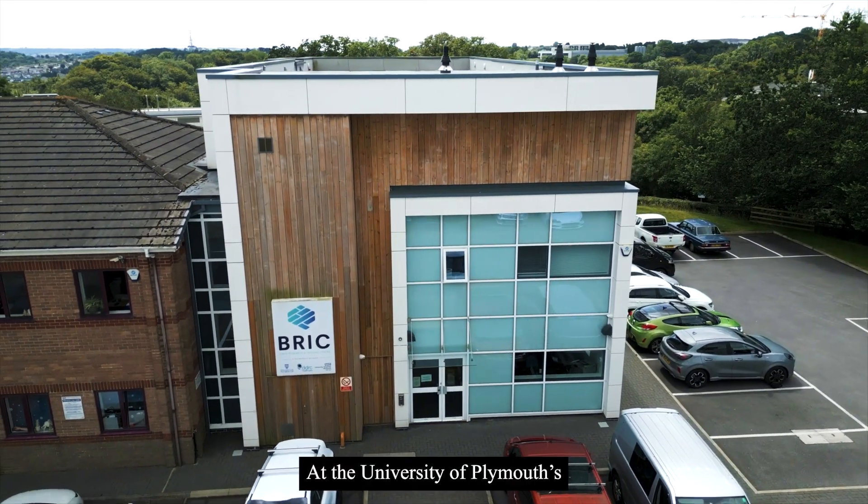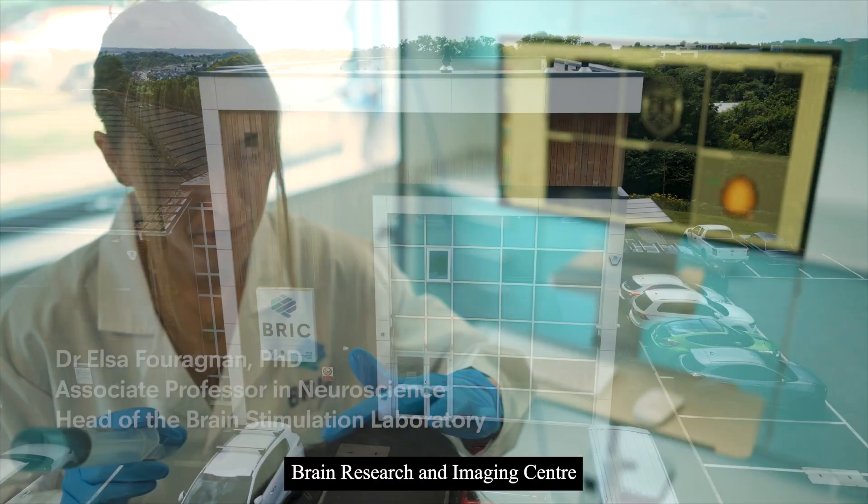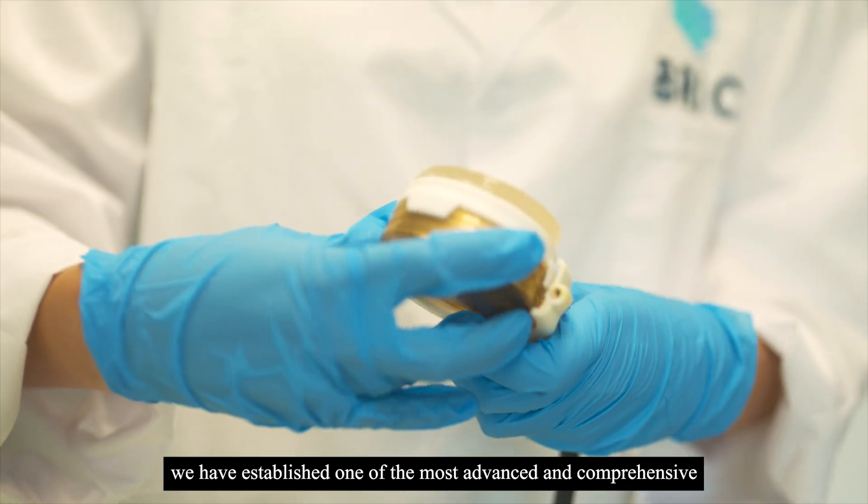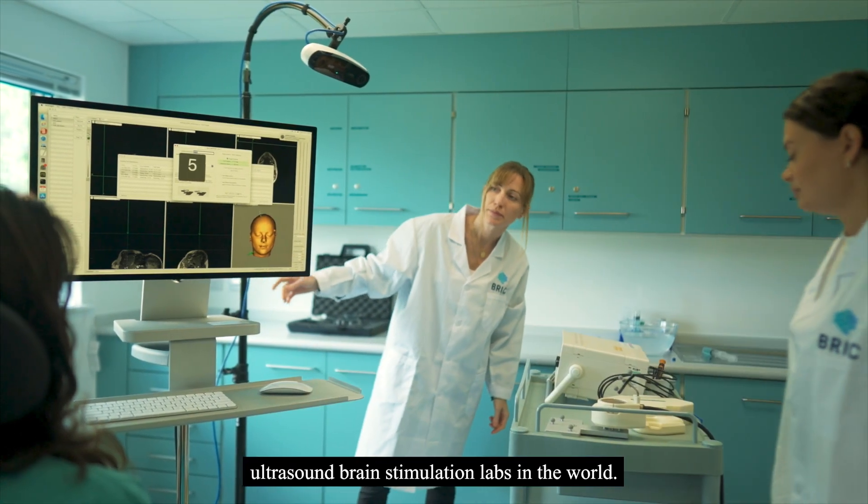At the University of Plymouth's Brain Research and Imaging Centre, we have established one of the most advanced and comprehensive ultrasound brain stimulation labs in the world.